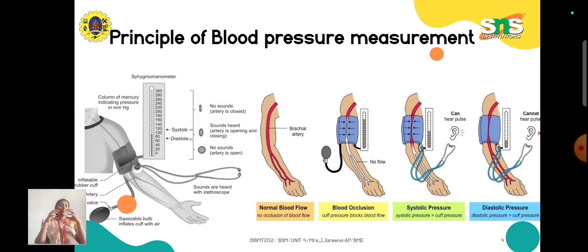Next, you keep on releasing the pressure. Now your cuff is deflated completely, and the blood vessel regains its original size. After some time the blood finds its own way and moves freely as before. That is the initial stage, before placing the cuff. It flows as it is flowing now, since all the pressure is released and the cuff is deflated.